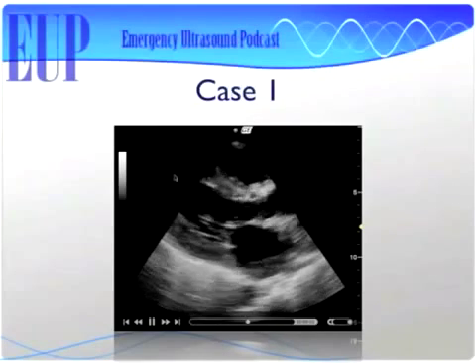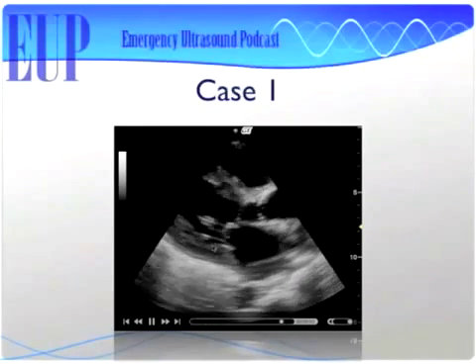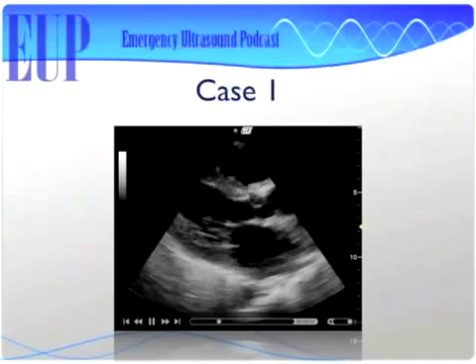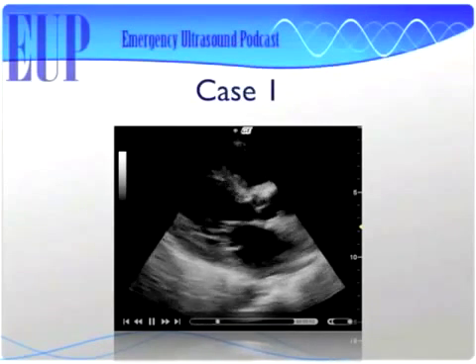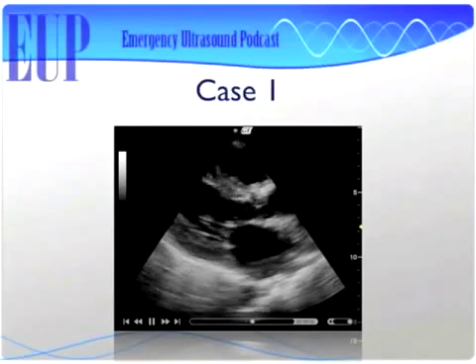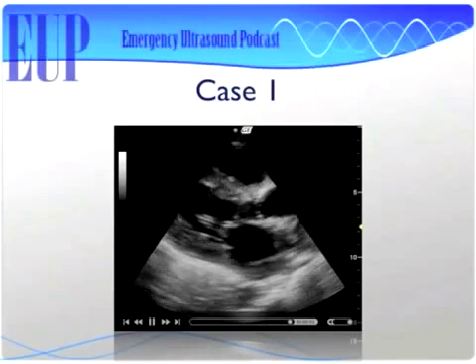That portion on the back side at the bottom of the screen. Okay, down at the bottom of the screen. The green part. I'm not sure that was actually green, but maybe it was green. Maybe it was yellow. Yeah, greenish yellow. Great. So you're telling me the septum looks good. Septum, LAD distribution looks pretty good. Nice. I like it when you start throwing coronary arteries at me. So yeah, I agree. The LAD distribution here looks like it's squeezing, it's moving.